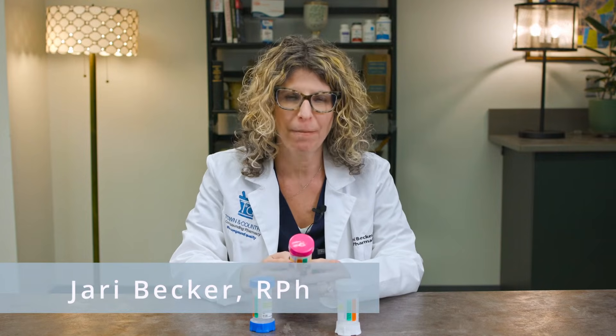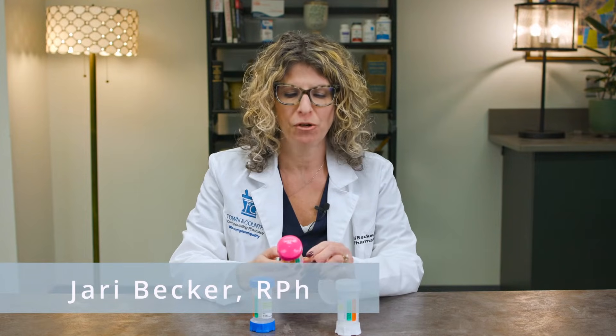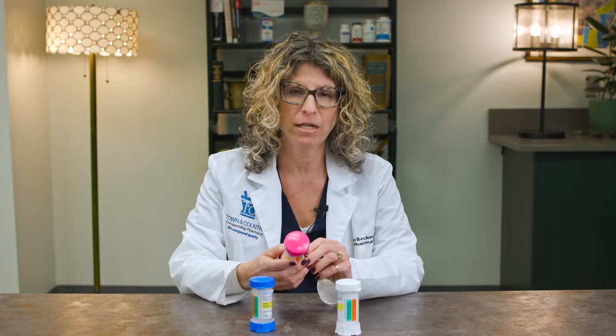Hi, I'm Jarry from Town & Country Compounding. I am going to show you today how to use a top-of-click dispenser.